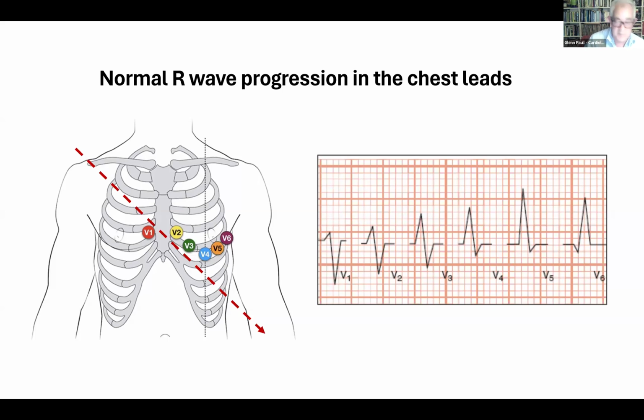If that means that you're able to lift the breast up and place V4 and V5 underneath the breast, or V3, V4 underneath the breast, and 5 and 6 maybe more towards the axillary, if that works, that's fine. If you find that's too low, it can go on top of the breast. What it's doing is getting that impulse from the heart. So as long as it's as anatomically correct as you can, if that's below the breast, that's fine. If that's above the breast, that's fine too. You hear this often, and I was involved in a state working group where we did some education, which I've tried to get access to for practice nurses, but it's a nightmare. That was the topic of much debate. So I think, just whatever you feel gives you the most accurate anatomic position.